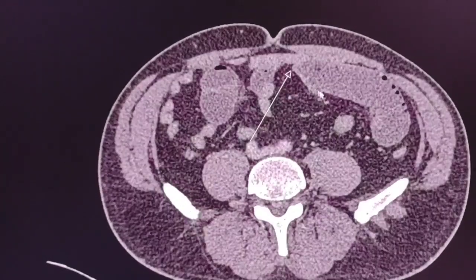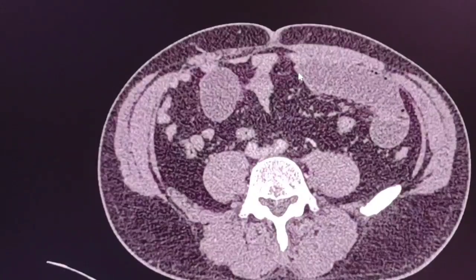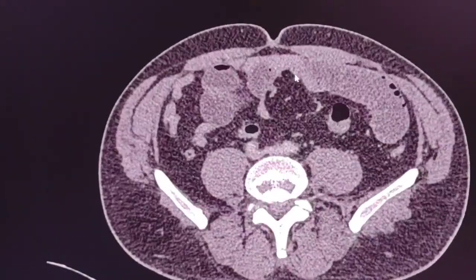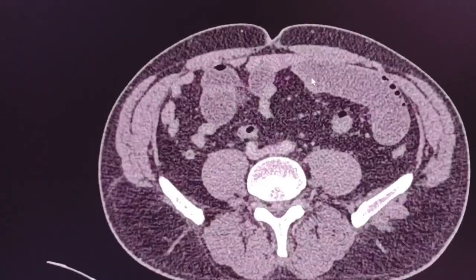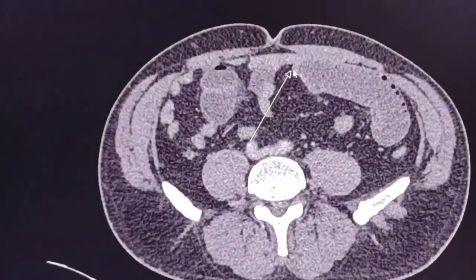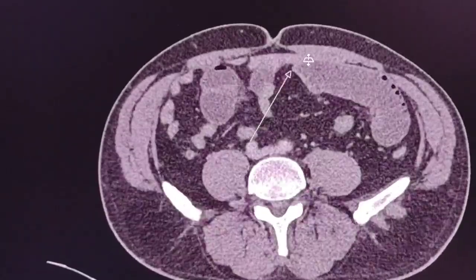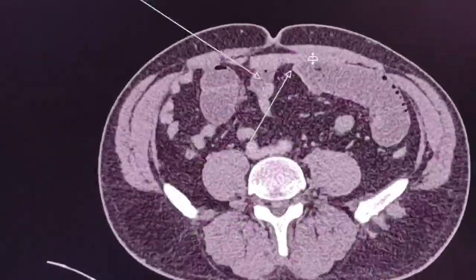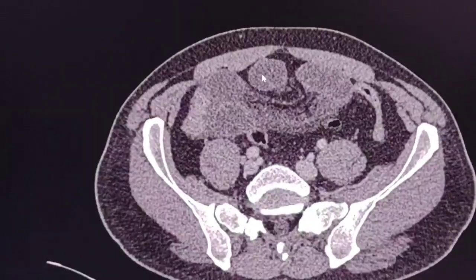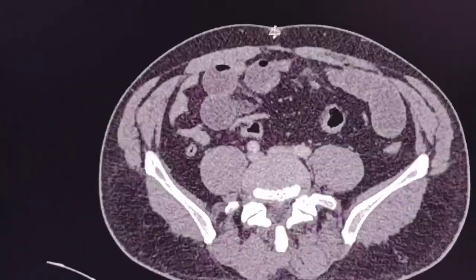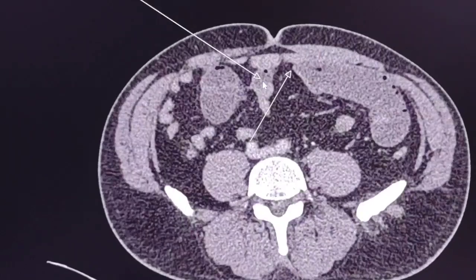I followed and tracked the small bowel and found two stenotic and abrupt transitional points. The first is here — as you can see, the dilated small bowel loop ends here with no continuation. On the other side, you can see a dilated small bowel ending here with a second stenotic point. There is no continuation; there is abrupt stenosis.